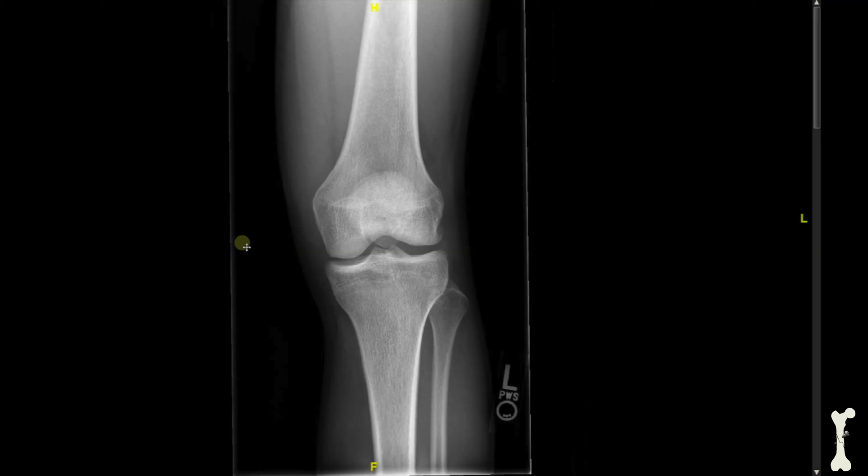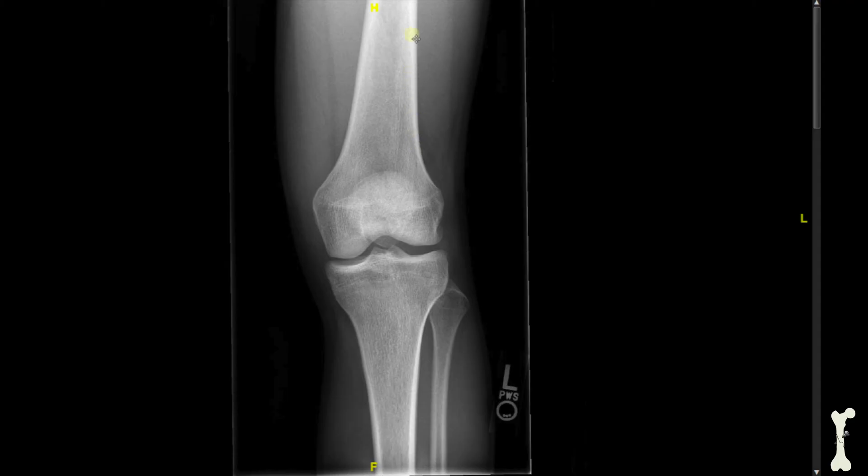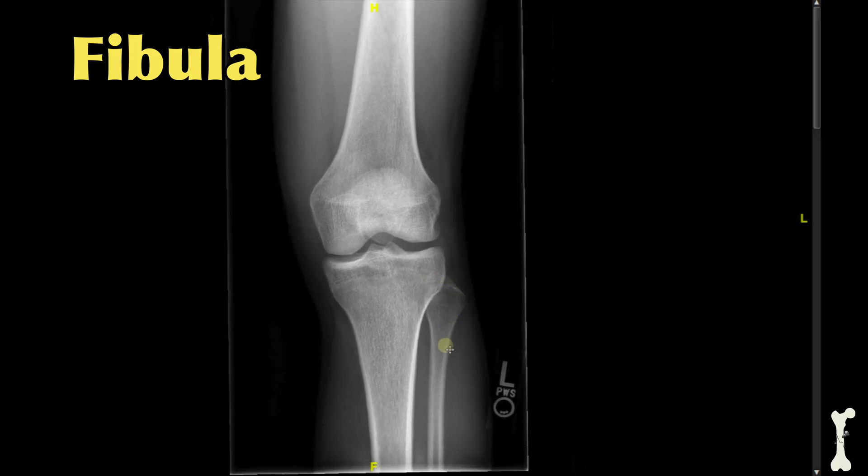If you're really interested in looking at soft tissue, an MRI scan would be a better option. Turning to the bones, you can see this is the thigh bone — the femur — running down in this direction. And then this is the shin bone, the tibia. And then finally there's a smaller bone here called the fibula. If you look closely, you can see this structure right here in front of the knee — that's actually the kneecap, the patella.